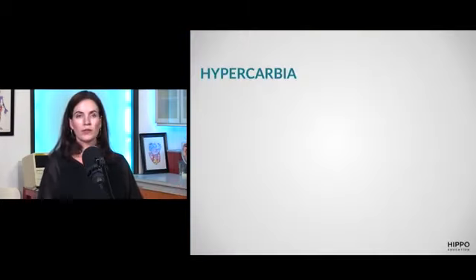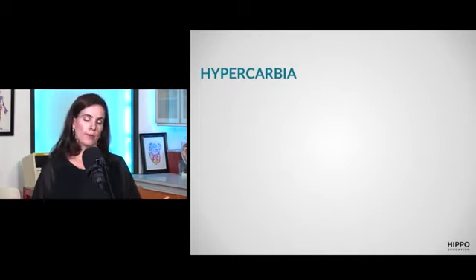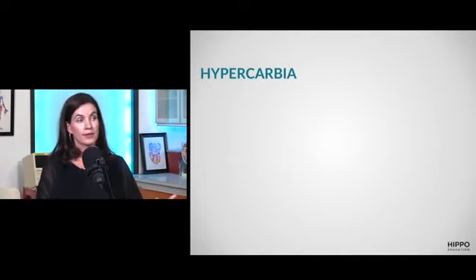Okay. So the second common problem we see in emerge patients is they are hypercarbic. Their PCO2 is too high. And so we have a couple moves on the ventilator for fixing this. Guys, do you have ideas of what we can change on the ventilator when the PCO2 is too high? You have to blow it off. Yeah. So how can you increase them blowing it off?